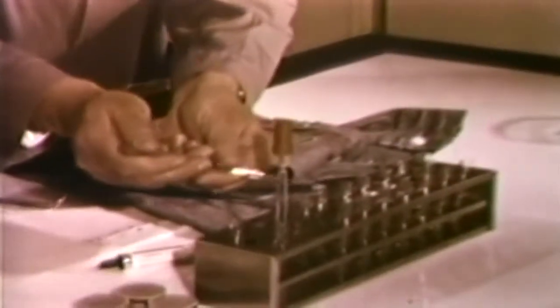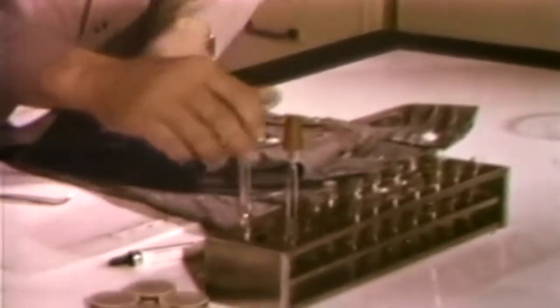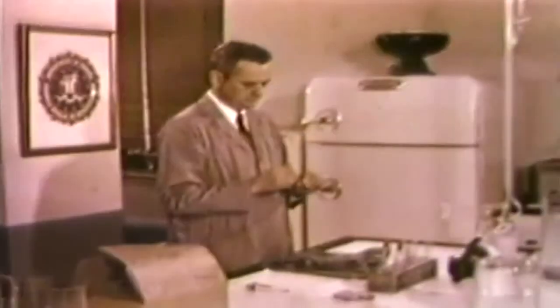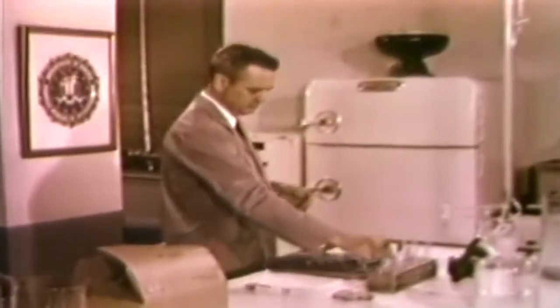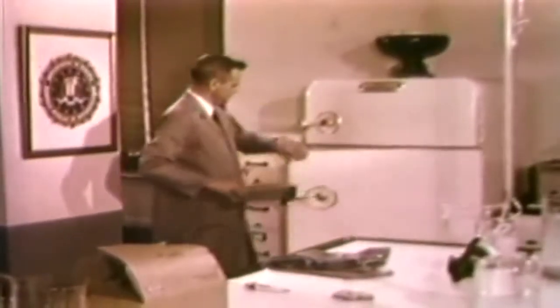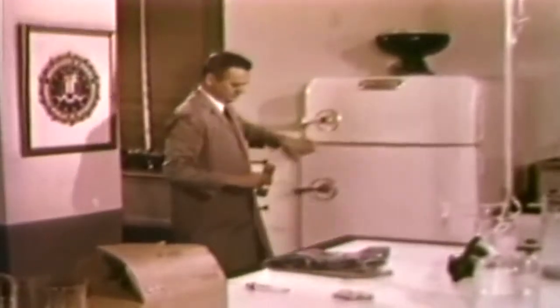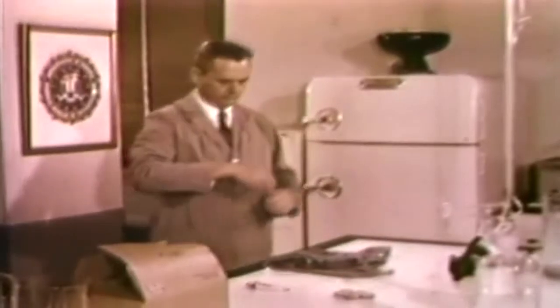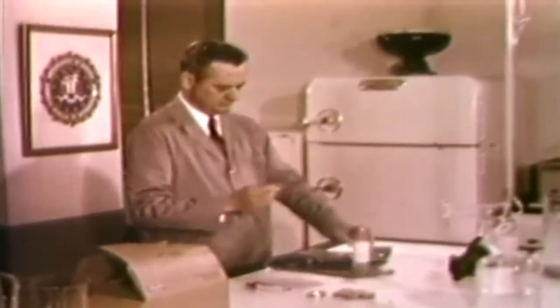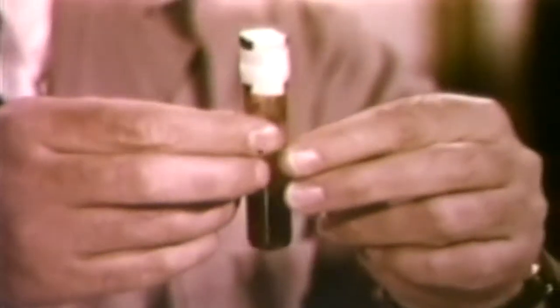First, known blood serums are added to both blood-stained cuttings and unstained controls. The rack is placed in the refrigerator overnight to allow the samples to absorb the grouping serums. This liquid blood sample from the victim was received in a sterile container without preservative by airmail special delivery. Since receipt, it has been under regular refrigeration to keep it cold but not frozen.